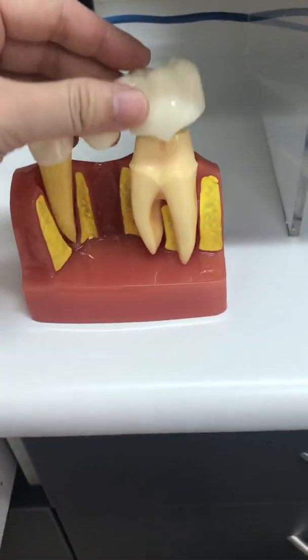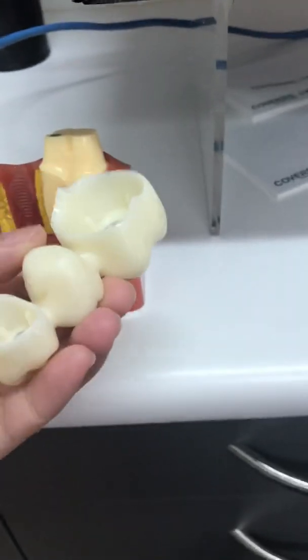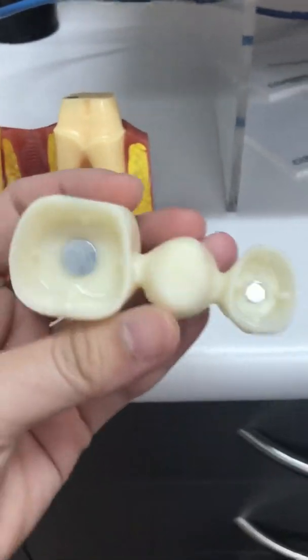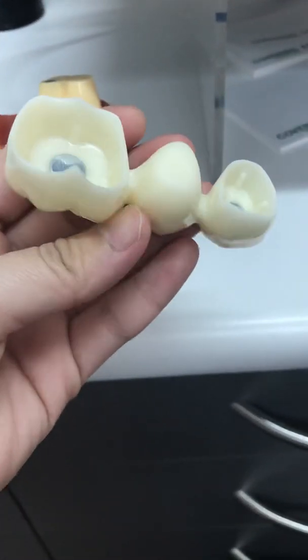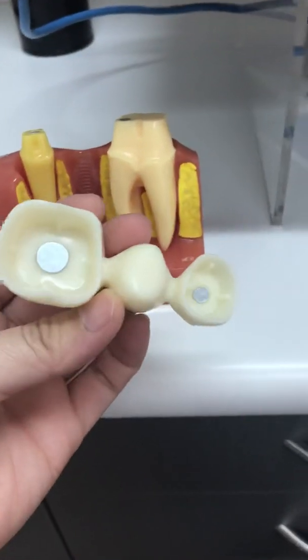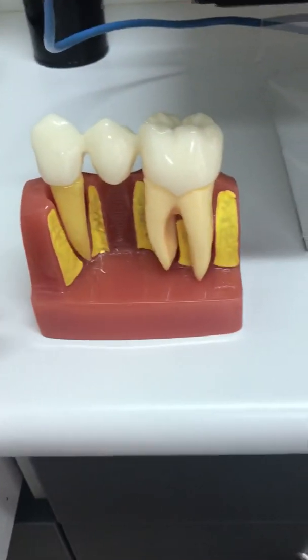In this video we're going to talk about crown cementations of different types of crown. There are basically three major types of crown. The first one is a full porcelain crown that looks entirely white. Full porcelain means the entire piece of crown or bridge is made of porcelain.